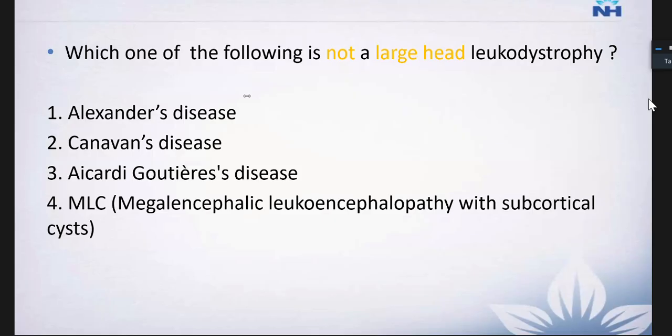Whenever pediatric neuroimaging is concerned, ideally you should take the spectroscopy at low and intermediate TE. The low TE is able to pick up small amino acid peaks, which happen at 0.8 to 0.9 ppm, which usually get suppressed at intermediate or high TE. So it depends on your clinical or imaging differential diagnosis. If given a chance, you have time, you should go ahead with low as well as intermediate TE.